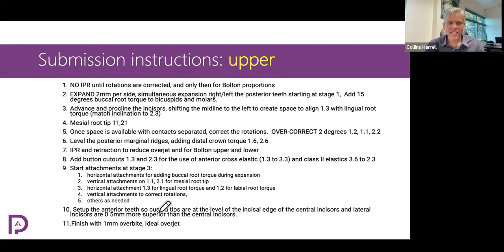I personally feel like as long as you go with a scalloped trim line, there's enough flexibility that the patient will be able to get their aligners in and out just fine with attachments placed at stage 1 at the first aligner. If you go with a high straight trim line, I think it's a good idea to wait a couple of aligners so that the teeth are moving a little bit before you try to add the extra retention with the attachments.